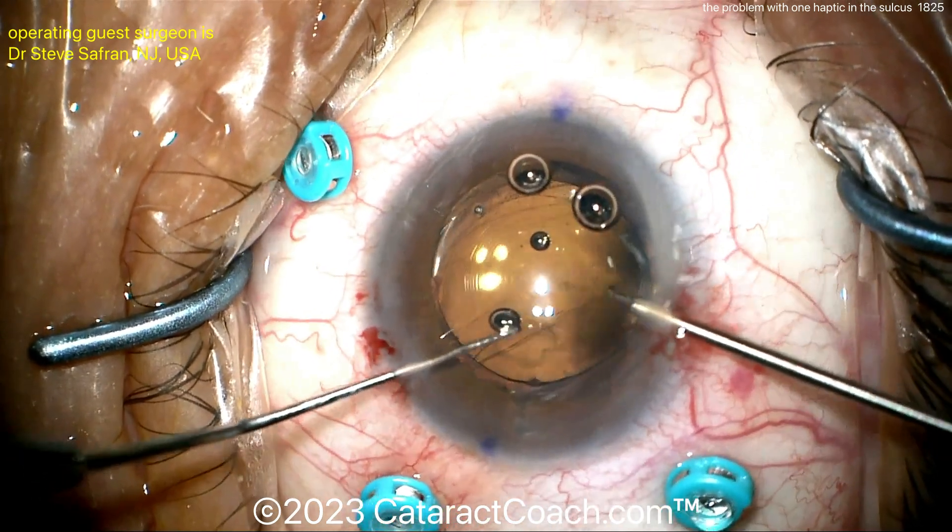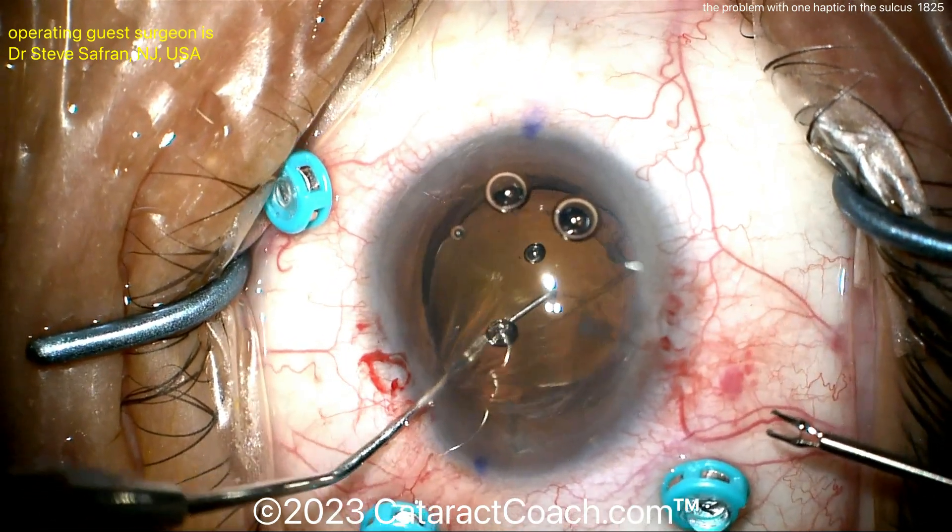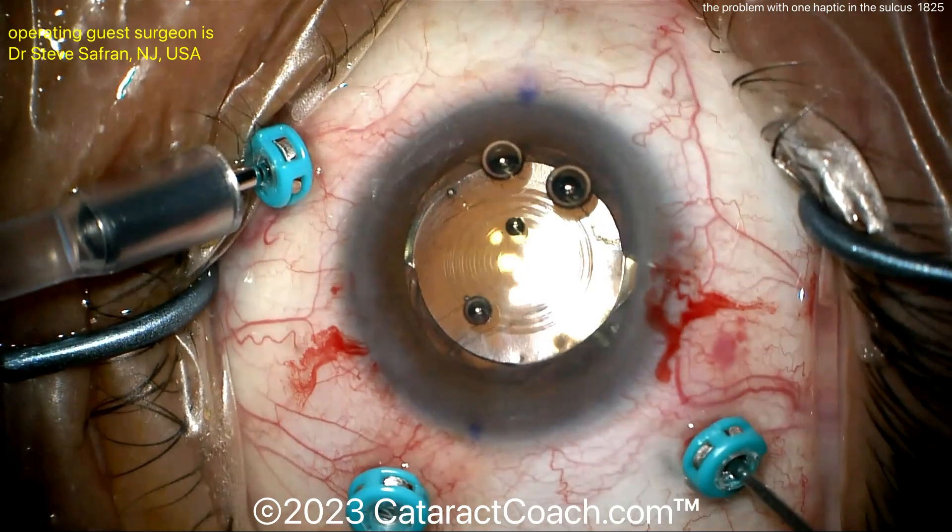And look — automatically it wants to center. So remember, most of the support here is going to be through those haptics, not necessarily at the optic. And now the lens is actually beautifully centered.